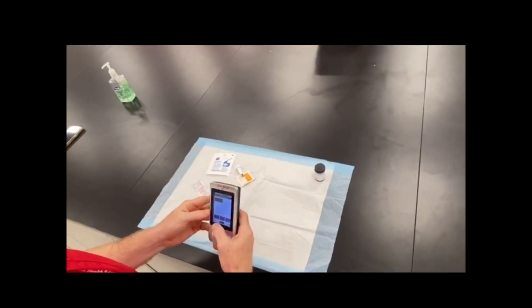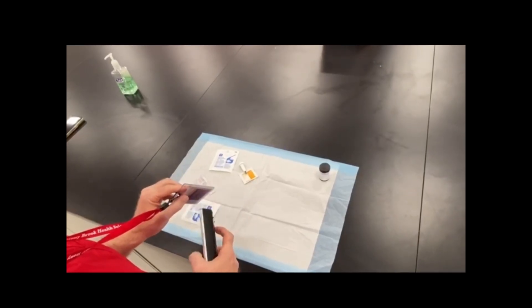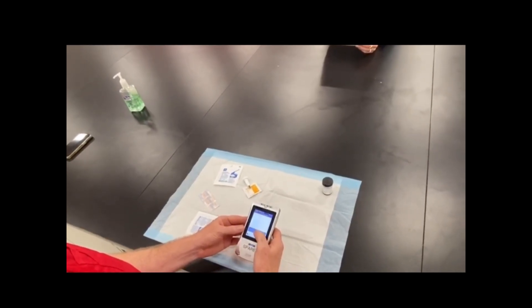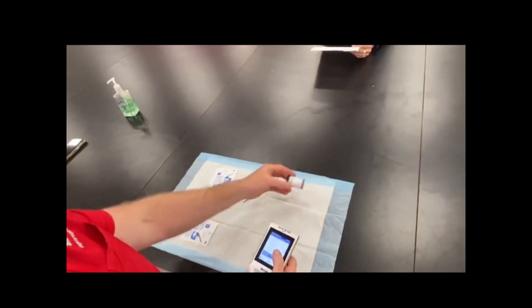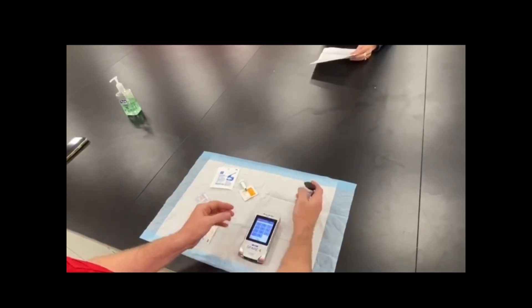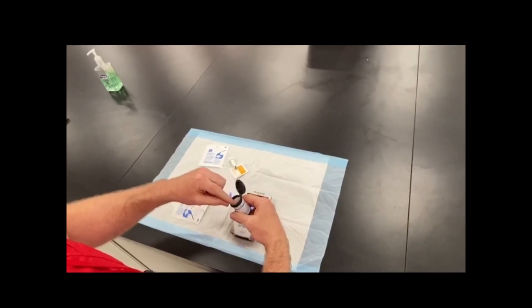Gather supplies. Turn on the glucose meter. Enter or scan operator ID. Scan the test strip vial and press OK to accept. Insert a new test strip into the port on the bottom of the glucose meter.